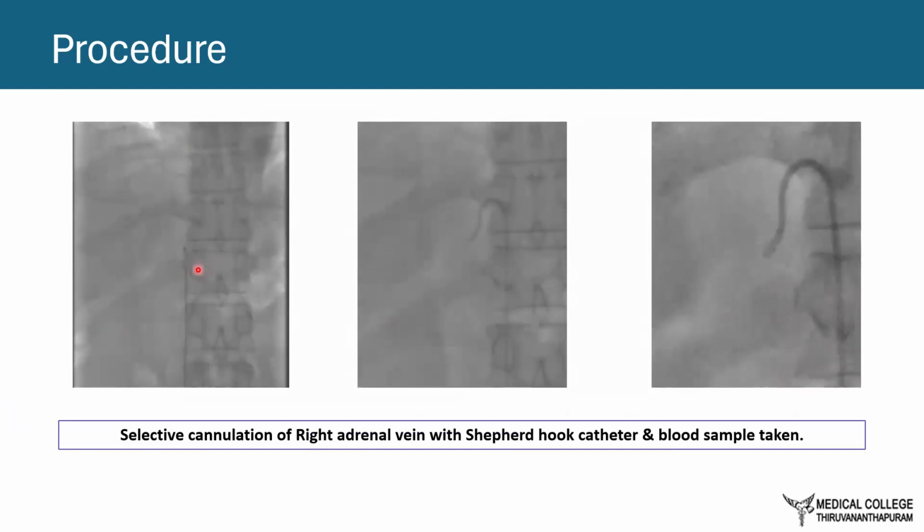So generally, from the very little experience that we have here, what we rely on mostly is the Shepherd hook catheter. We are not getting it from our vendors that much. So we have a Shepherd hook catheter which is ETO sterilized and reused in many of our patients whenever it becomes available. But our alternative is either SIM1 or, if not going with that, Cobra.